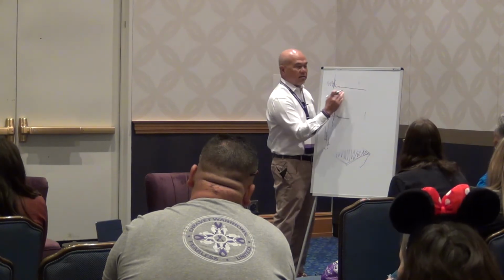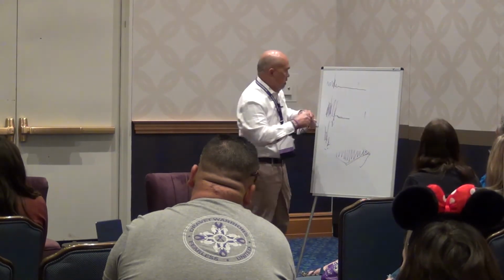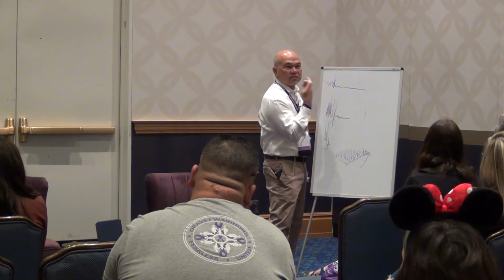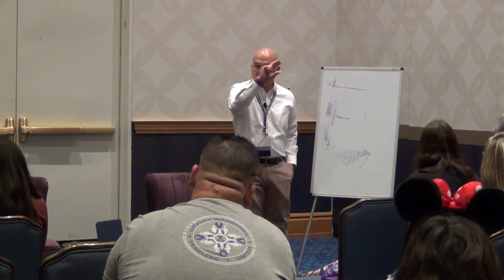Are you guys familiar with infantile spasms? You know, the babies that do this. You see the spikes, and then the EEG becomes suppressed or flattens out. We call it electrodecremental response. Everything just kind of shuts down for a few seconds. So there are different signatures on EEG.